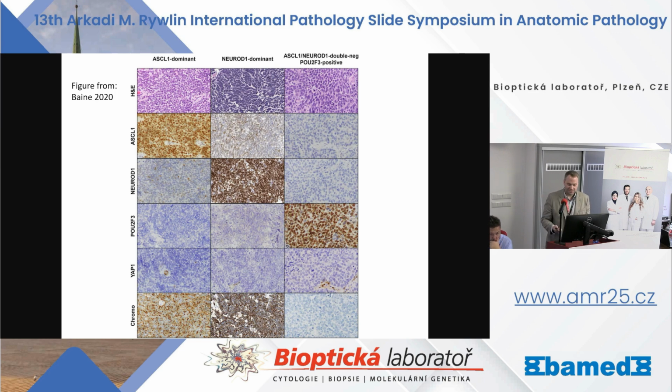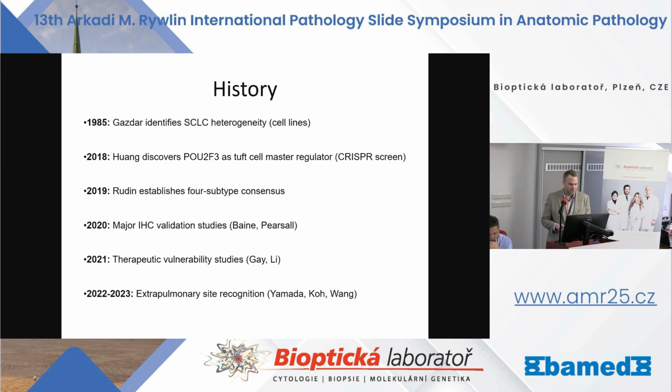But presumably only if it has clinical relevance, which in this case there's some early evidence for that. But anyways, the history of it is pretty interesting, as I think all of us know. If it looks like small cell, you can call it. Just make sure maybe it's not lymphoma, even if the neuroendocrine markers are negative. I know some people won't even do the neuroendocrine markers because they can be negative.